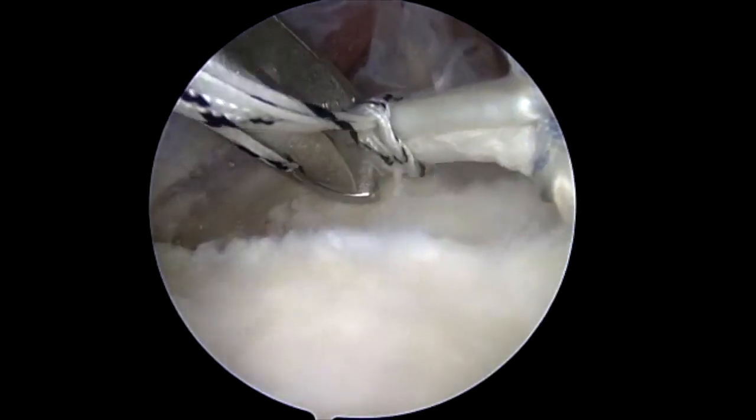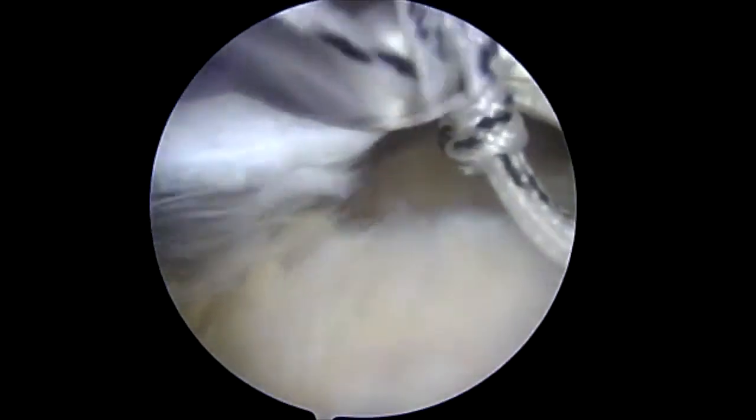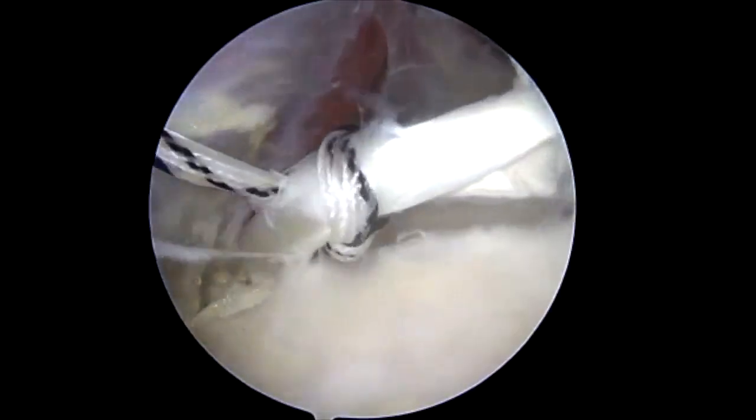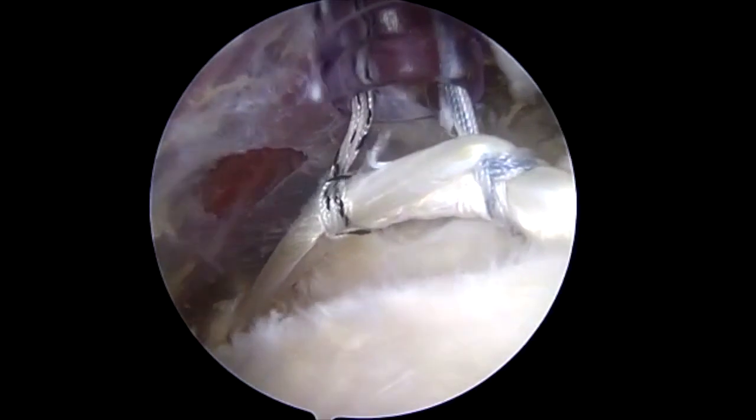Returning to the first suture, a tack stitch is placed in a similar fashion. Notice that the tack sutures are placed as central in the biceps tendon as possible to prevent pull-out. The double loop-and-tack construct is complete.